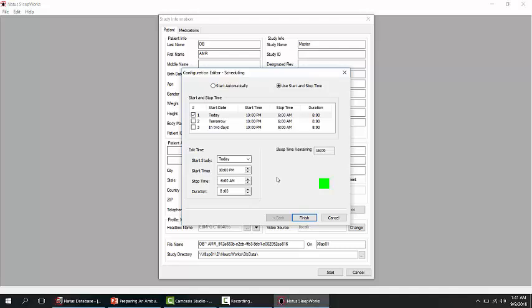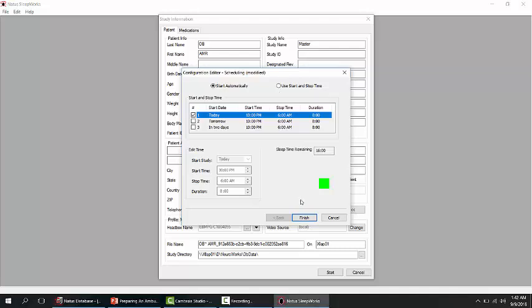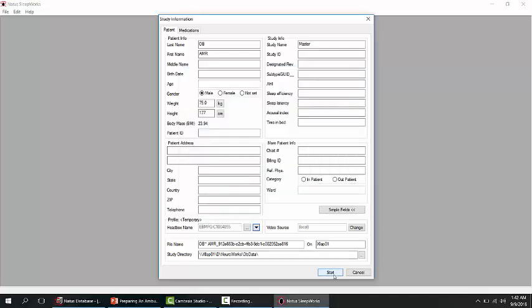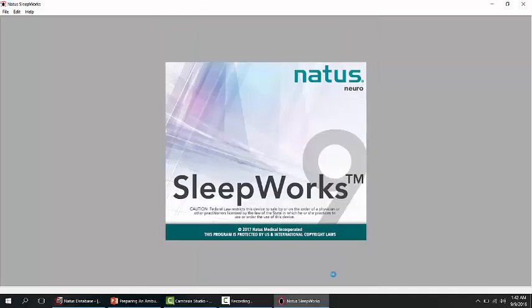From this window you can modify the study schedule. The auto start mode relies on obtaining valid biological signals like SpO2 and effort bands. The other option is to choose a scheduled start and stop time. If you are done, click Finish, then Start, and wait momentarily.